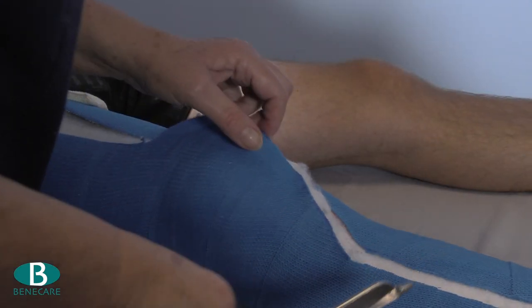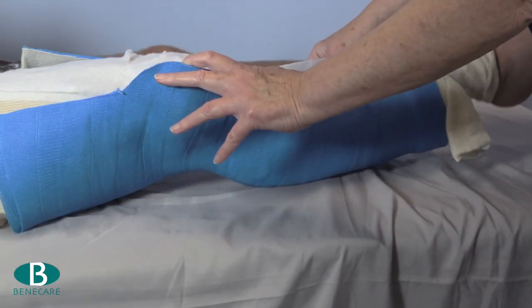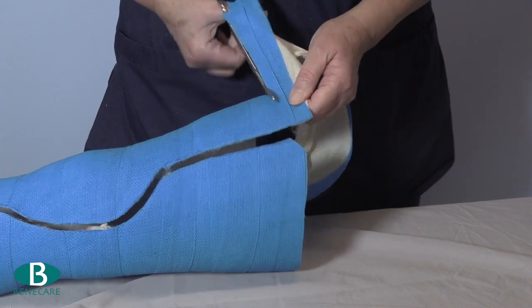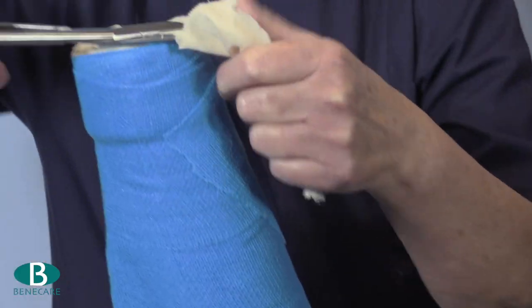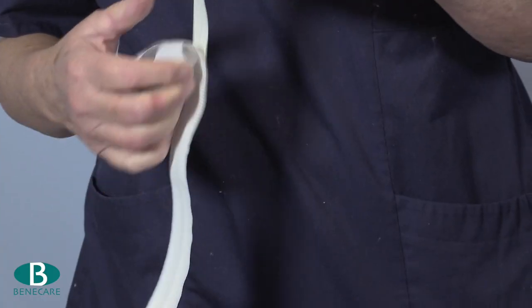Trim at each extremity of the cast, and edge using either elasticated strapping or fleecy edging tape.